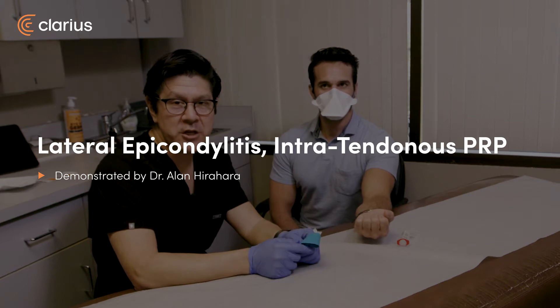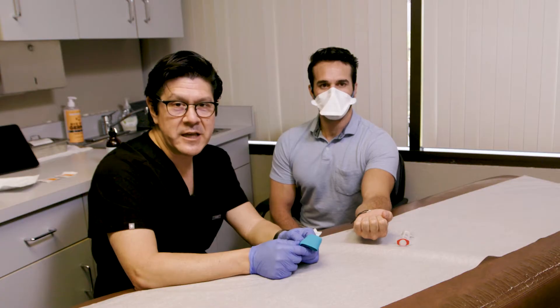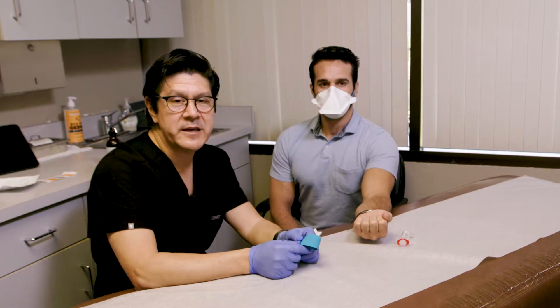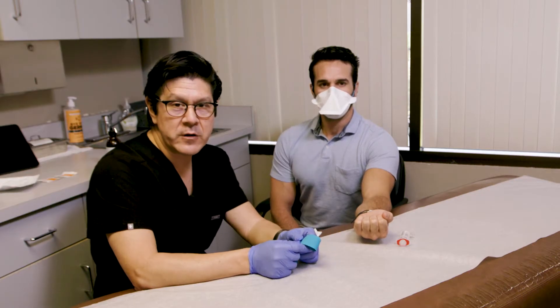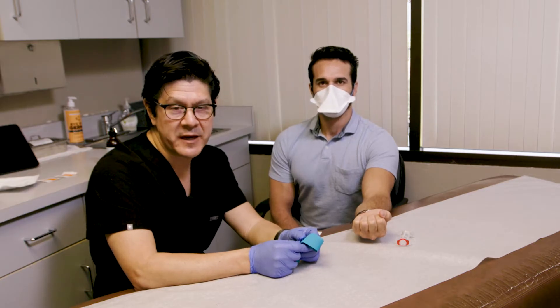Today we're going to be doing a PRP injection to the lateral epicondyle. This patient has lateral epicondylitis and has failed conservative management, so we're going to be going into the tendon using ultrasound guidance to make sure we're accurately placing the PRP exactly where we want, to give him the best chance of healing and resolution of his pain.